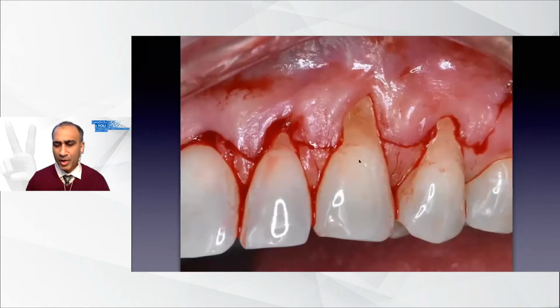So we start off by making our incision design. And here I did essentially a hybrid between the conventional trapezoidal flap with a vertical releasing incision coming across the papillas, and then an oblique incision to avoid having a vertical in the aesthetic zone, a la Professor Zucchelli and colleagues with the surgically rotated papilla. I then raised the full thickness flap to the mucogingival junction, and then beyond the mucogingival junction, dissected split thickness to obtain maximum closure and release.